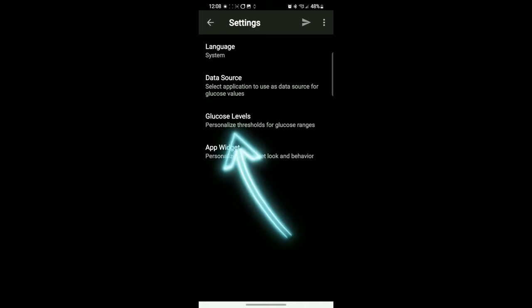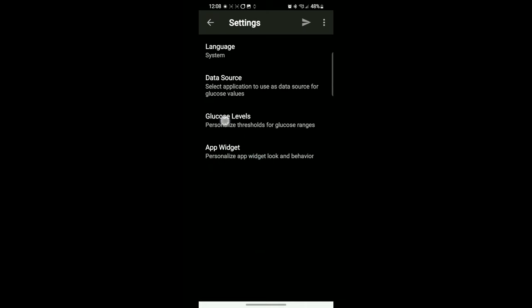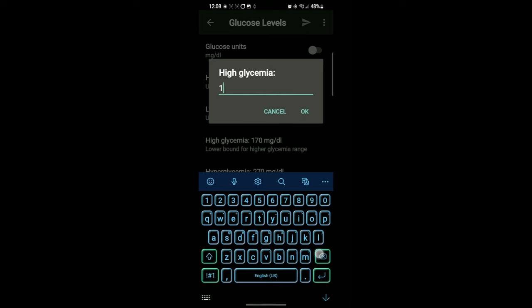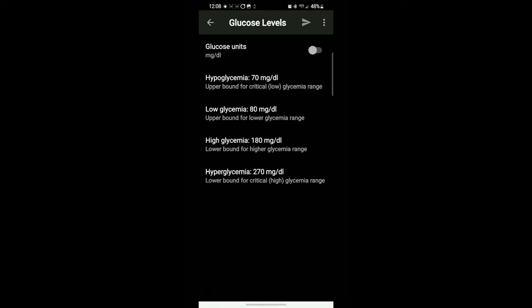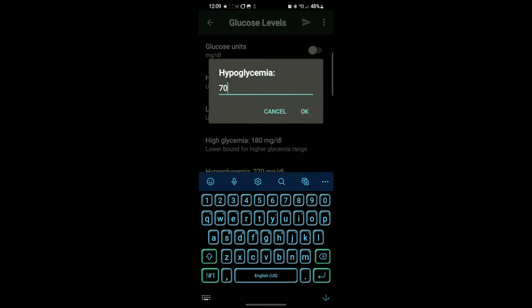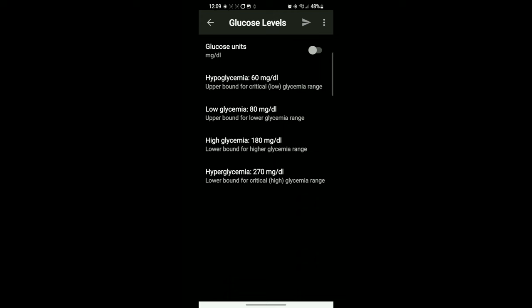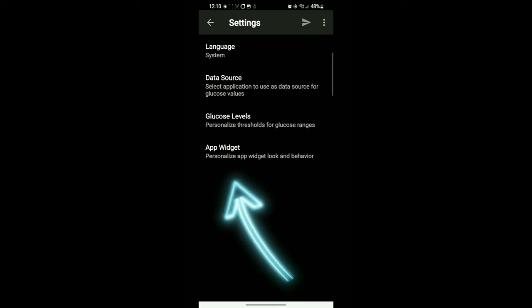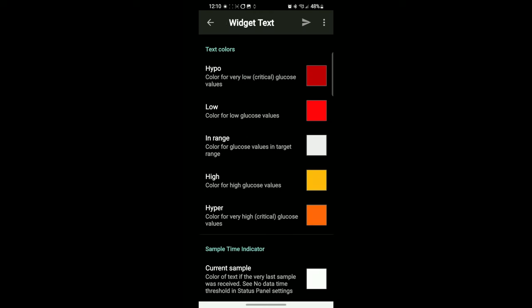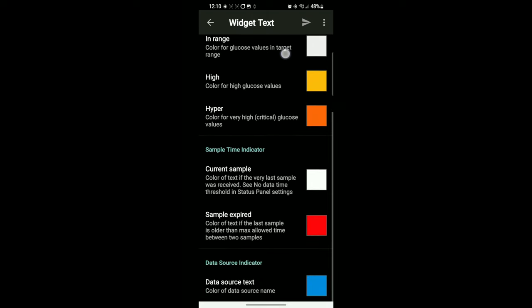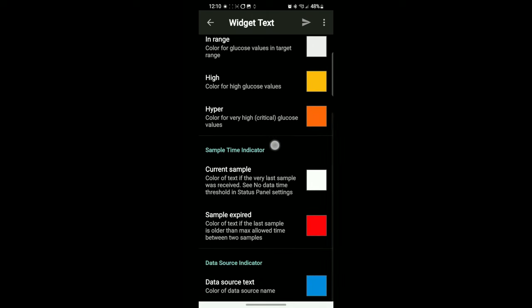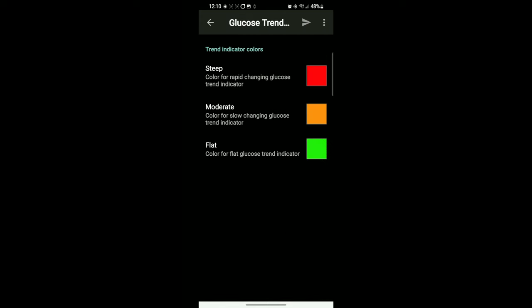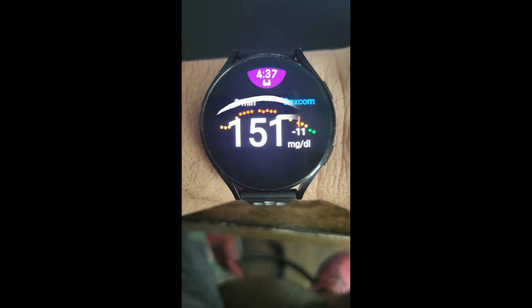Then you go back. When you go to glucose levels here, you can see a couple different options. Set up your highs and your lows. So my high is 180 and I like to see my low, my hypoglycemia, I don't like to see that until it's around 60. Make sure the right milligrams per deciliter. And then go to app widget. This is just kind of like how it's going to look when you're done with it on your trending graph and all the different colors and options it's going to give you. We won't mess with this too much right now, but I just wanted to let you know what it's going to look like. These are the different colors on your glucose trend graph, those colors there.